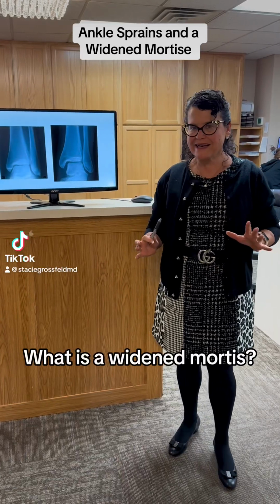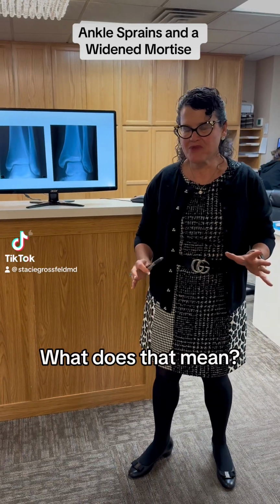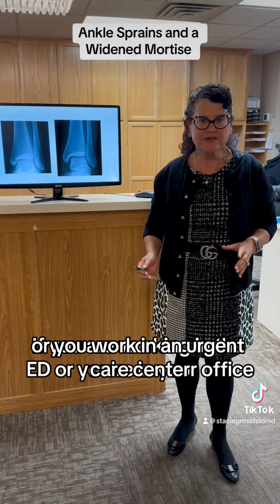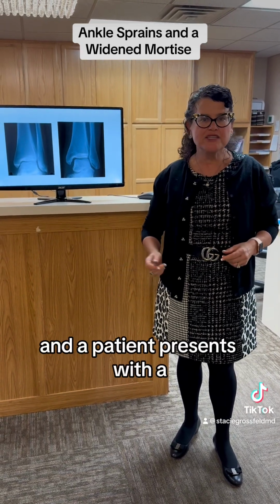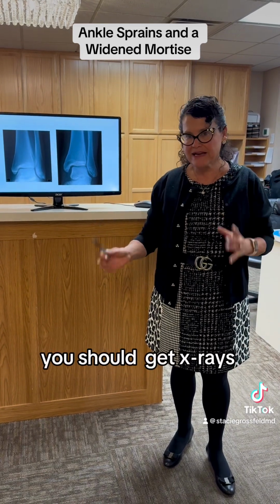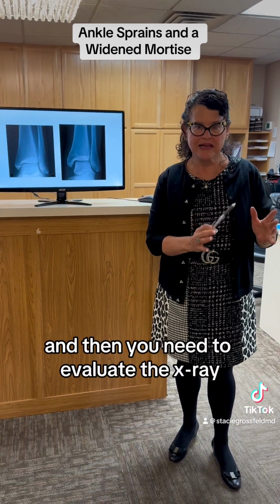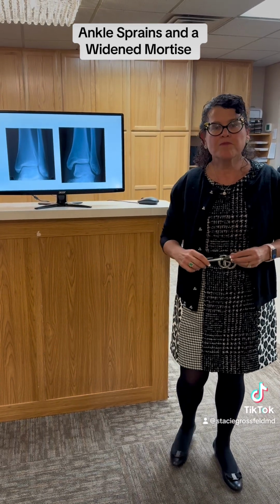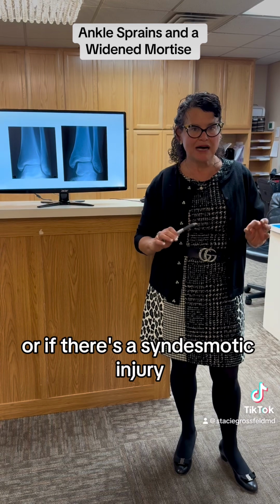What is a widened mortise? What does that mean? So if you're working in the ER or you're in your office or you're working in an urgent care center and a patient presents with what you think is an ankle sprain, you should probably get x-rays, and then you need to evaluate the x-rays specifically to see, number one, if there's a fracture or a broken bone, or if there's a syndesmotic injury.